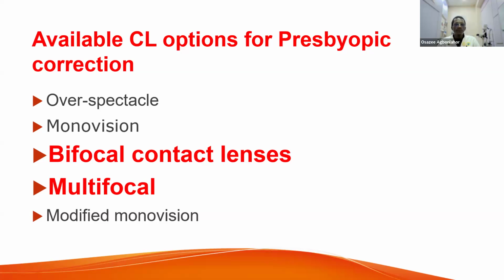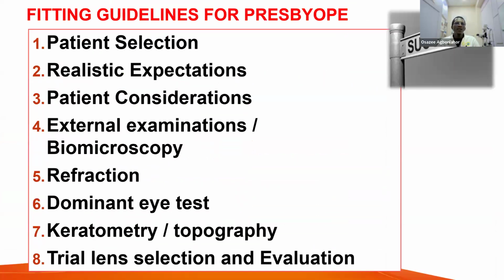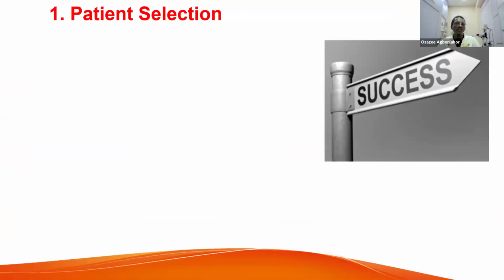So that's for monovision. But bifocals and multifocals is a bit different, and that's what we're going to be focusing on today. So these are the fitting guidelines. I will not stress a lot of these points because they've been stressed already. Just mention a few of them that are unique to our presentation this evening.